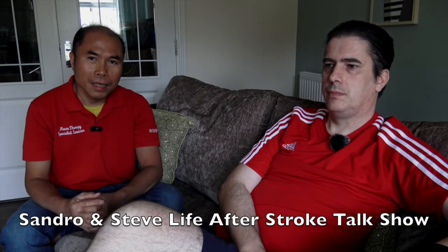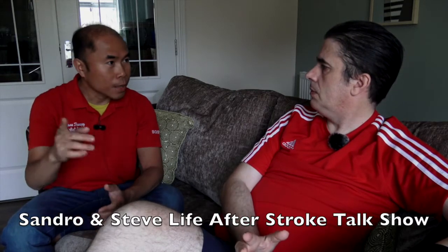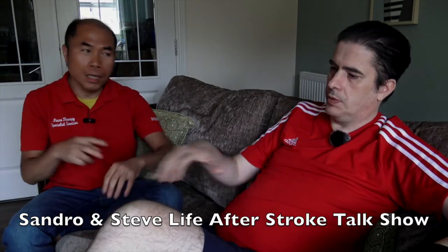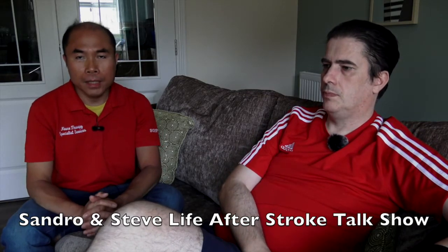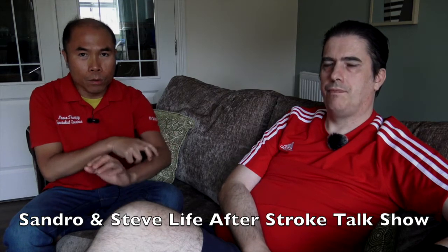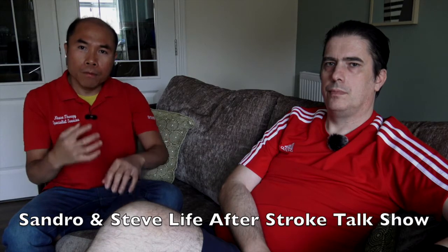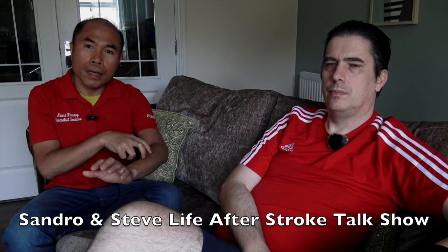It's just like anything else in life, but the way to make it work is actually to go with the flow of the electricity, to use it as an adjunct. So I'm looking forward to it. I mentioned a while ago, active assisted. The patient must actively try to control the muscle, to try to do it. And then what you cannot provide yourself volitionally, the electricity will supply.